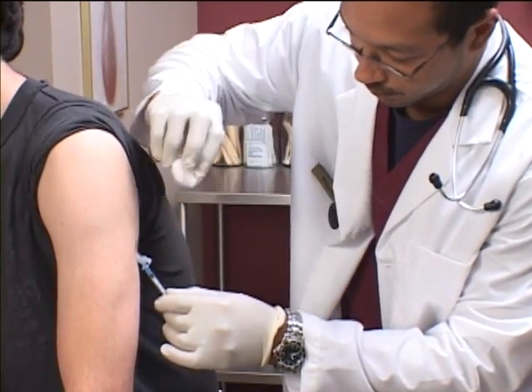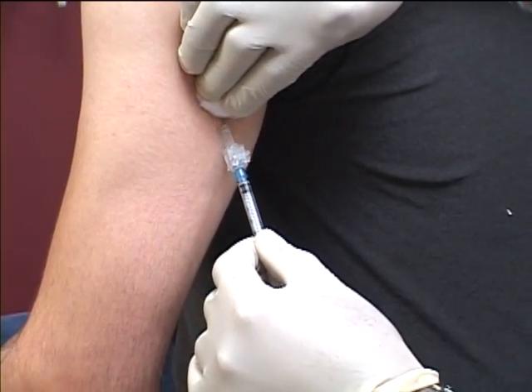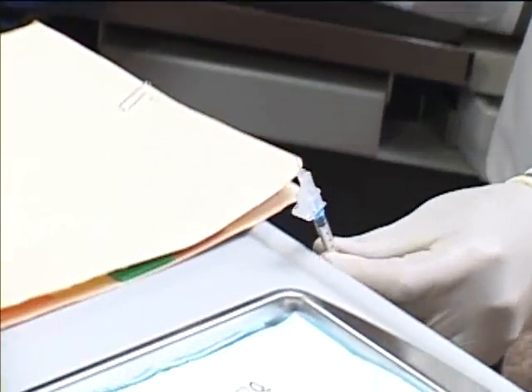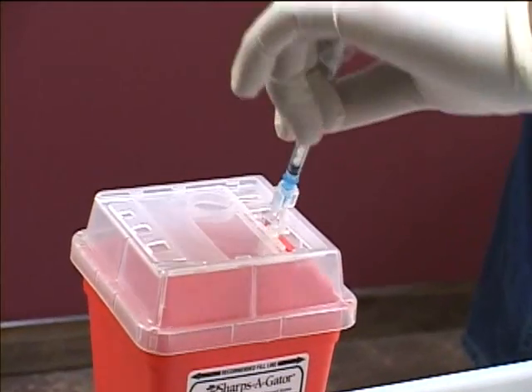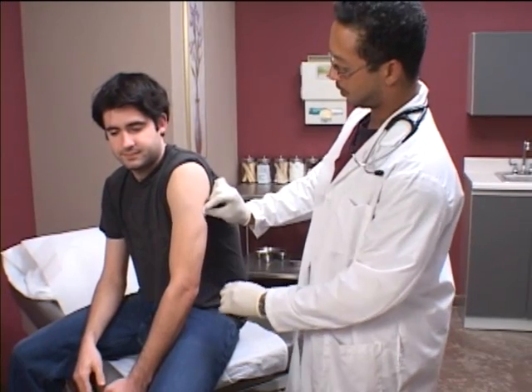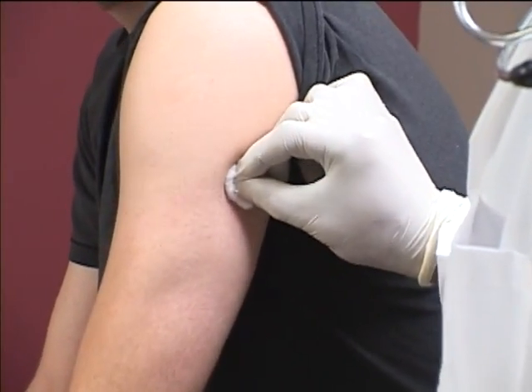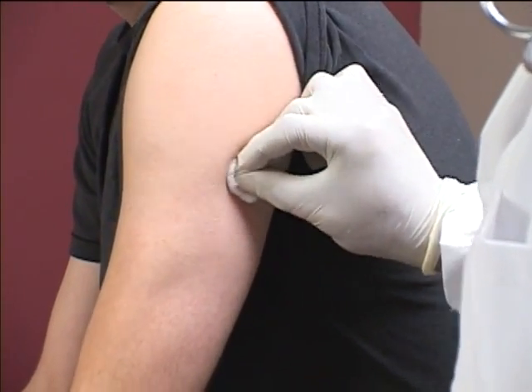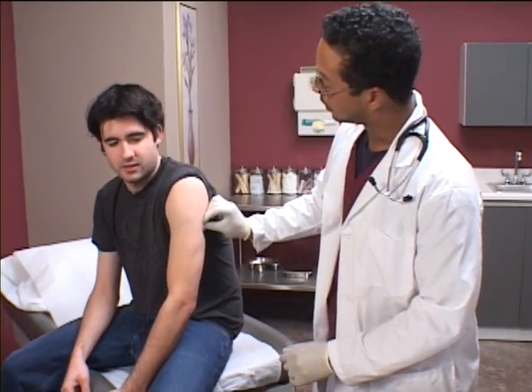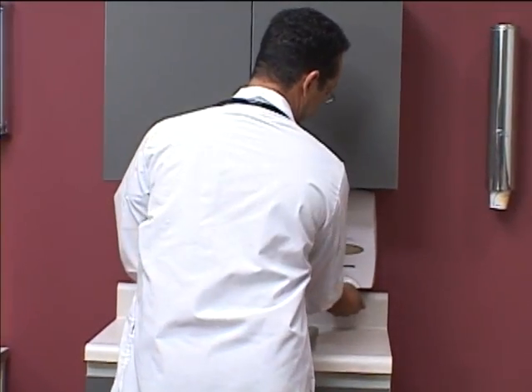When finished, apply gentle pressure to the skin above the needle with a cotton ball. Withdraw the needle. Slide the safety sheath over the needle and discard the needle into a sharps container. Stimulating circulation improves drug distribution and absorption, so unless contraindicated, gently massage the site. Check to see if the patient needs a Band-Aid. Remove your gloves and wash your hands.